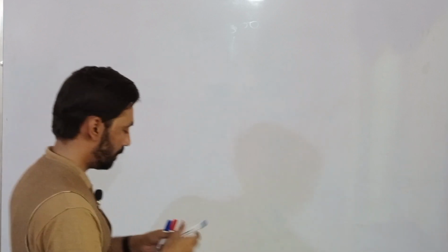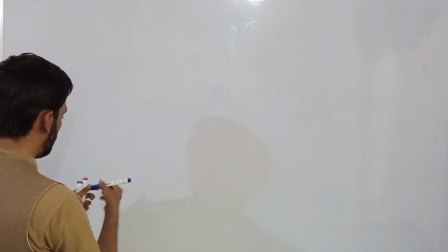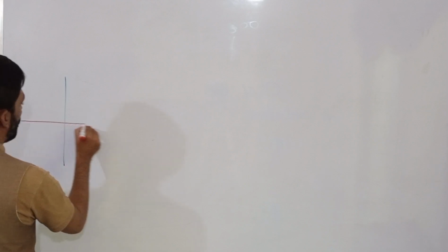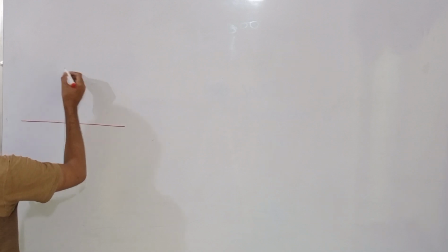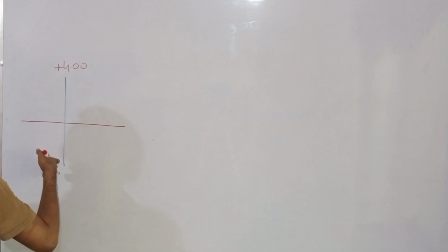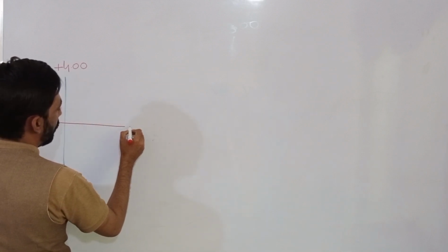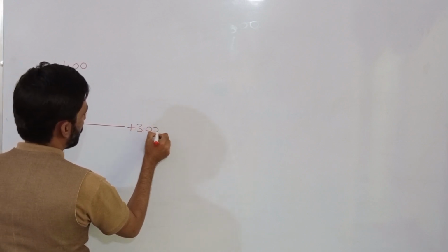So suppose when you perform the static retinoscopy, in the optical cross, as the accommodation is at rest, at the vertical meridian the neutral point is +4, and in the horizontal meridian, the 180 meridian, the neutral point is +3, right?